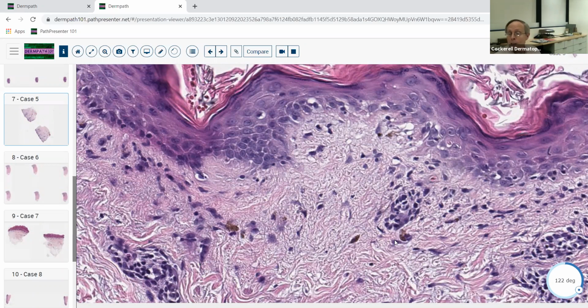And you should also think about dermatomyositis in the same breath, or a lupus-like or dermatomyositis-like drug eruption. And this happens to be dermatomyositis. You can't tell DM apart from subacute LE or acute LE. They look almost identical under the microscope. So it's really not our job, if you will, to distinguish those two.